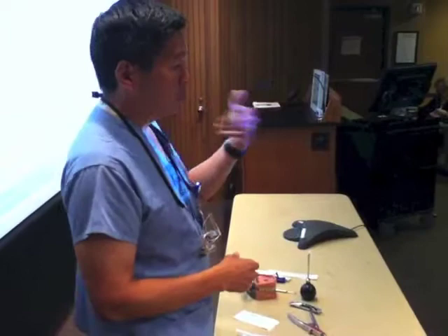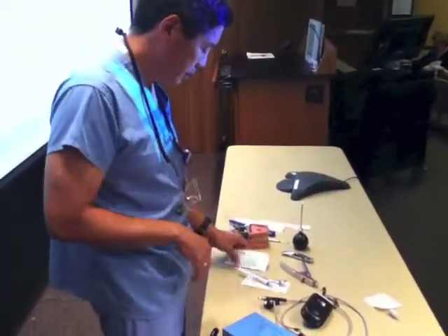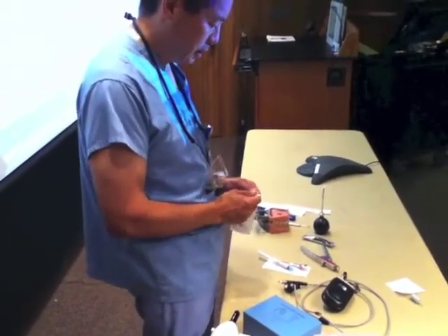Then get them numb, rinse out the socket. This is a two-step system — it's not terribly cumbersome, but still it's an extra step.